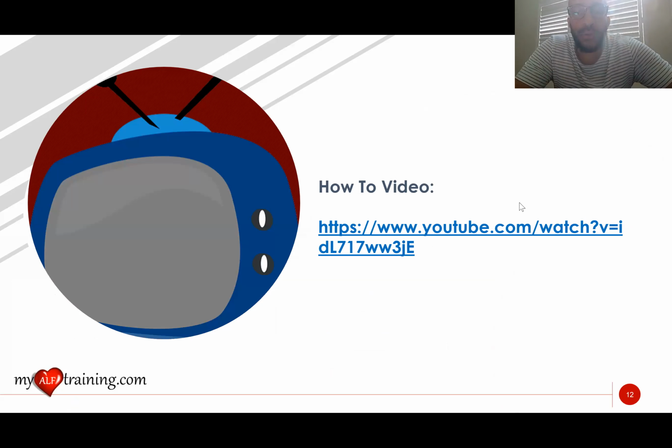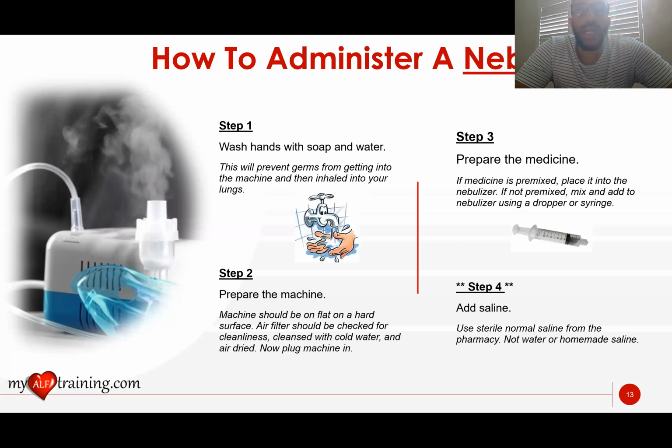We already did our how-to video, so let's talk a bit more about administering a nebulizer. So one thing that was not covered in the video that I showed you guys, but we should already know as healthcare professionals, is to always wash our hands with soap and water. Now, why is it more important to wash our hands with soap and water when we're administering a nebulizer medication?